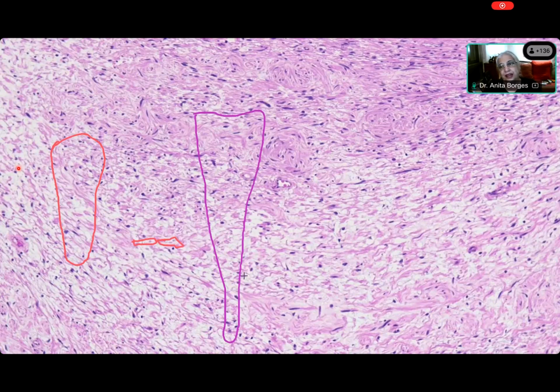They're going to be thinner than that. No, when you grate it, they're long and they are thin. Now everybody can see that the collagen over here is long and thin. You don't even need to draw the second line. That's how this grated carrot looks. So you're grating and grating and you're getting long strips. So this collagen is like you have been grating carrots. And that is the famous shredded carrot appearance.